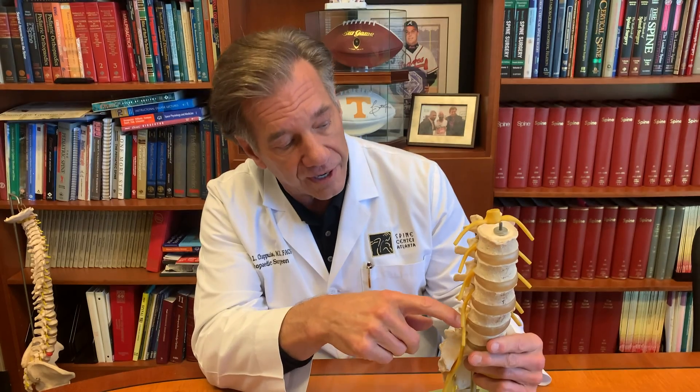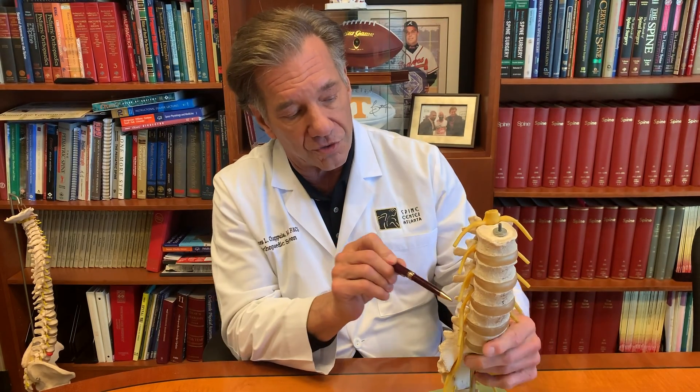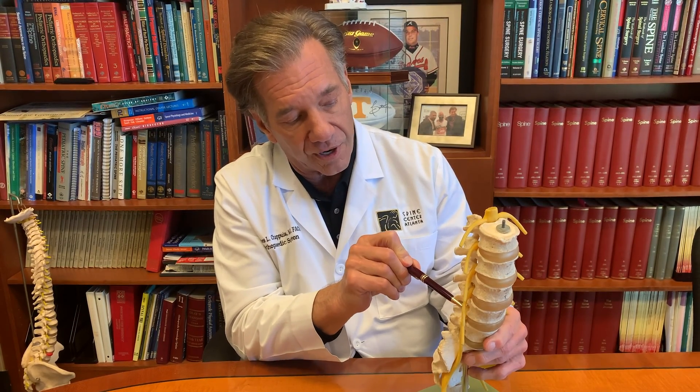How could they become problematic? First of all, when they're put in, if they're malpositioned, they can cause pain from irritation of the nerve root at the associated level. So if the pedicle screw was placed in here but it was malpositioned, it could irritate the nerve root.